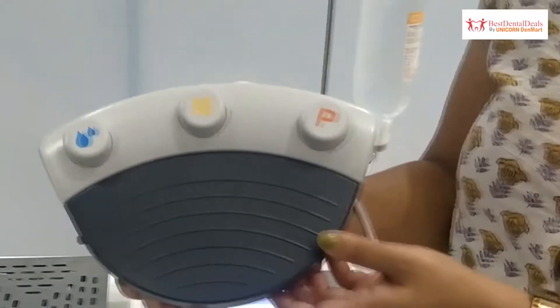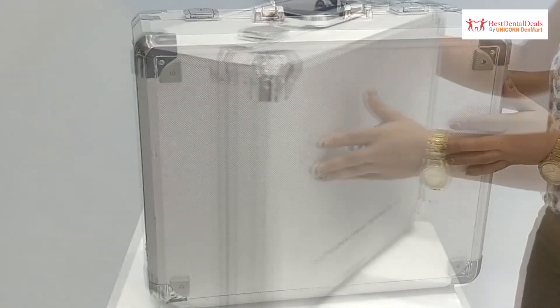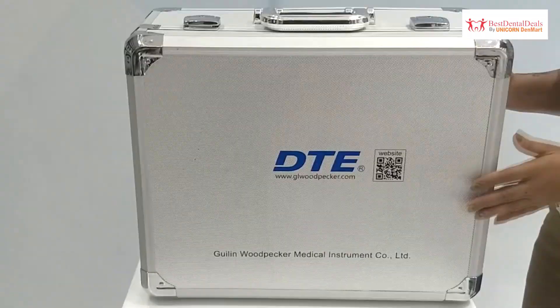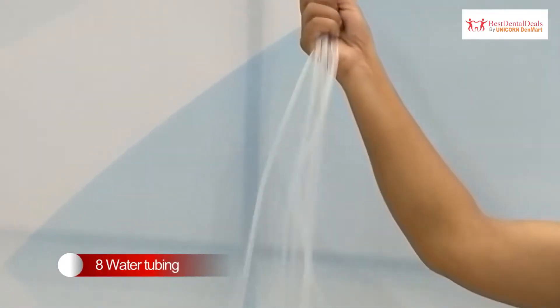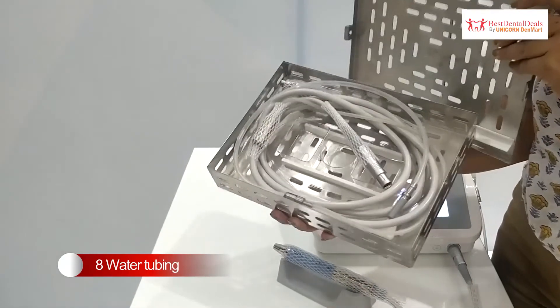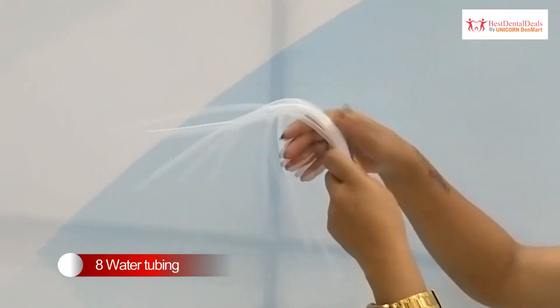Power is adjustable from 10 watts to 70 watts. The unit is available with a complementary aluminium case, adding to its portability. Surgery X offers a total of eight water tubings — two are attached with the LED handpieces and six come separately as backup.